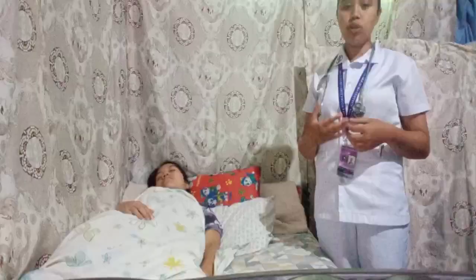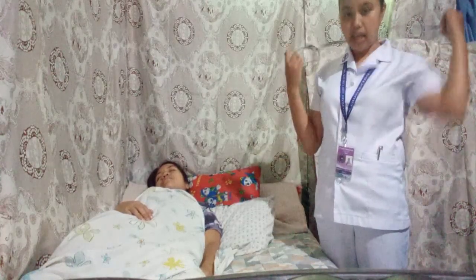Auscultated the heart anatomic sites, aortic, pulmonic, tricuspid, and the apical or mitral for the heart sound, extra heart sounds and murmurs. Ask the client to breathe regularly while auscultating. Repeated the preceding step while the patient is in the lateral position, then at the sitting position, leaning forward and briefly stop breathing after exhalation.